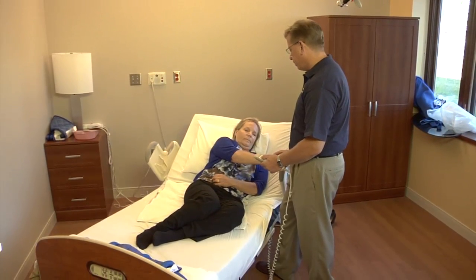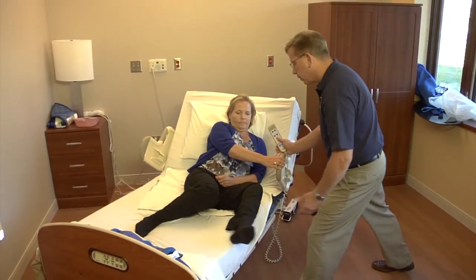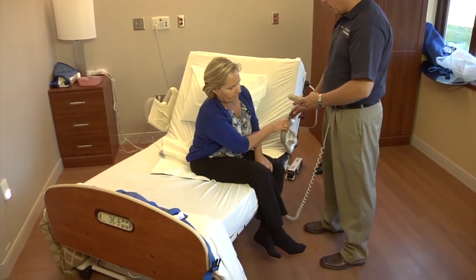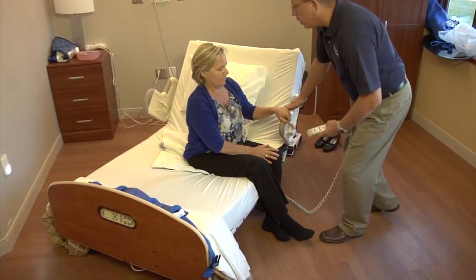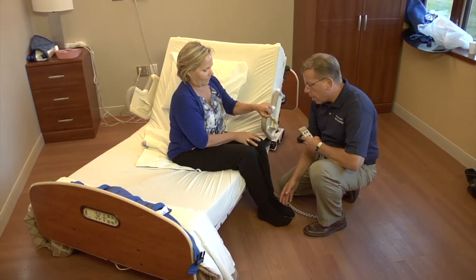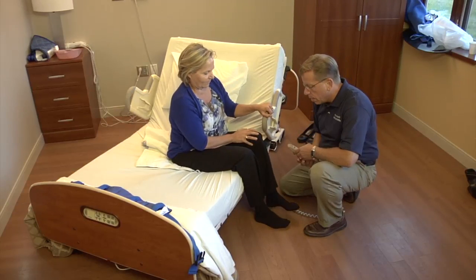So what you're going to see in this clip is Bob is working with the patient to assess their ability for readiness to stand and bear weight. This egress out of bed can take a very short time to determine how safe the maneuver will be. So the bed is put in a good transfer height, which means the patient's feet are on the floor and they can stabilize. He's checking balance. As they weight shift, are they able to hold their balance?